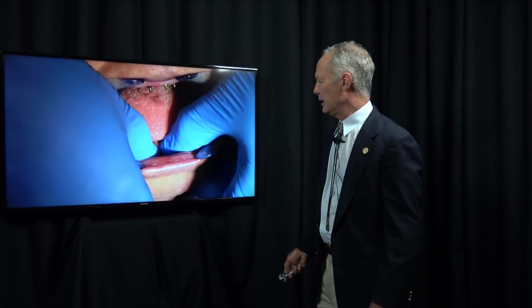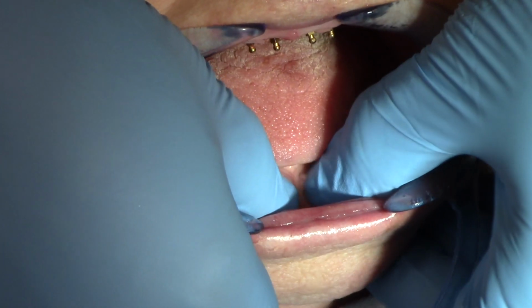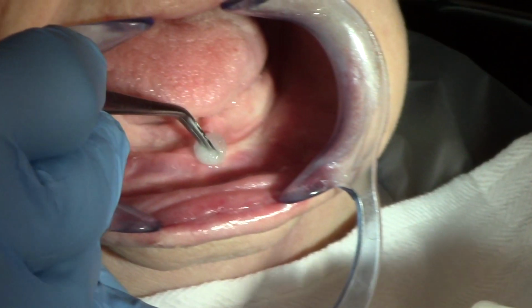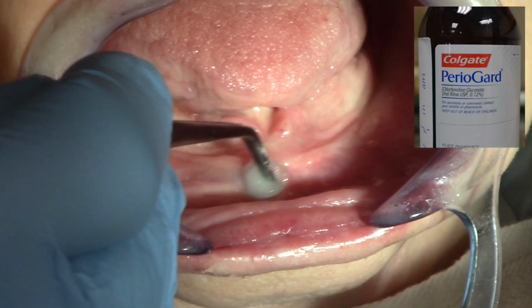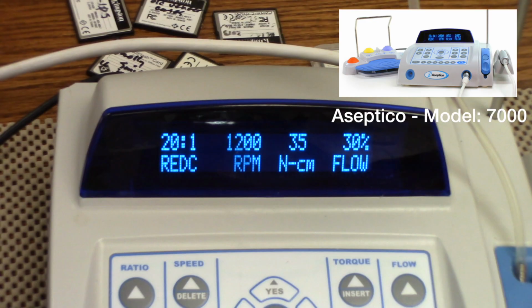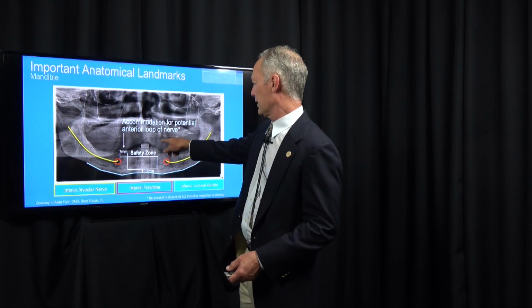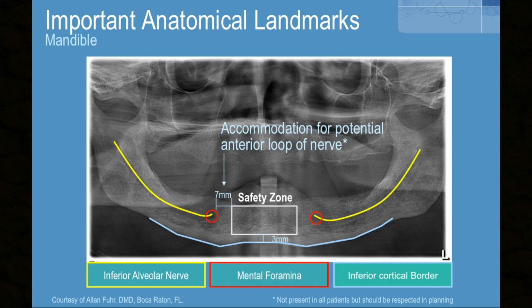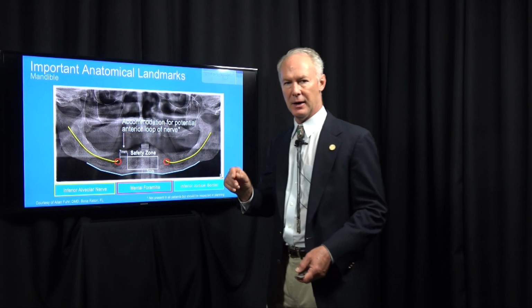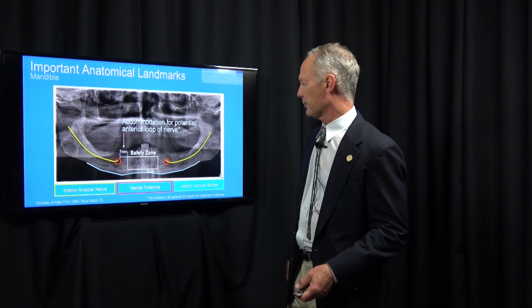Okay, so I'm palpating the mandible and just determining the extent of the bone of the alveolar process. This is chlorhexidine, and I'm going to start with a pilot drill at 1200 RPMs. Something you want to be aware of is the safety zone. You'd like to be 7 millimeters anterior to the mental nerve if possible, so you avoid the mental nerve loop.